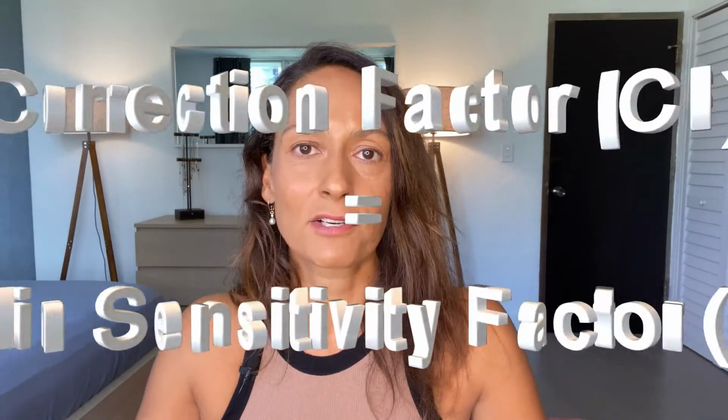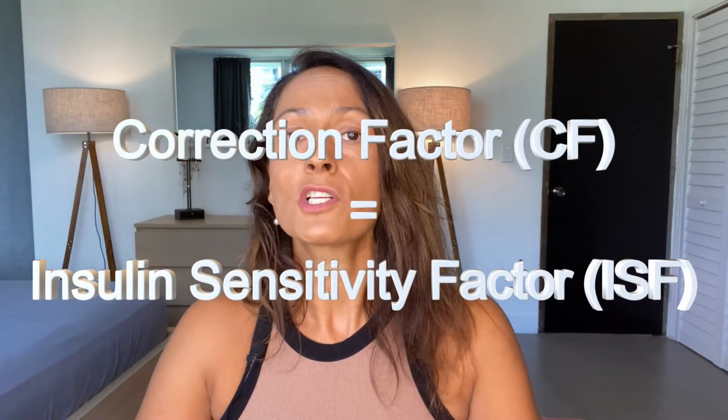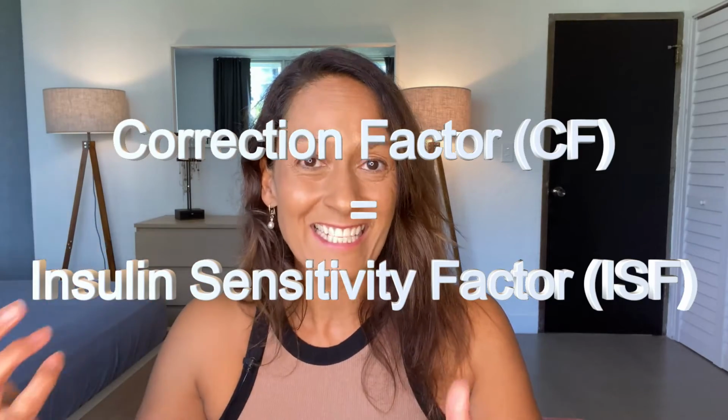The Endocrine Society's recommendation is that you adjust your insulin based on what your blood sugar will be in 30 minutes rather than what it is right now, but not that you calculate your future blood sugars, but rather that you use your correction factor. The correction factor is an indication of how much 1 unit of mealtime or rapid-acting insulin is going to lower your blood sugars. If you use an insulin pump, it should be in your settings. If you use insulin pens and you do not know your correction factor, you should have a conversation with your doctor and just get that ironed out first. Let's have a look.